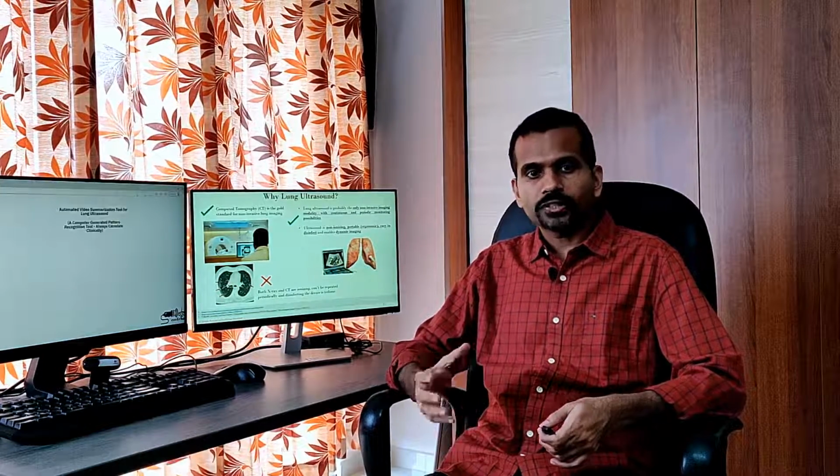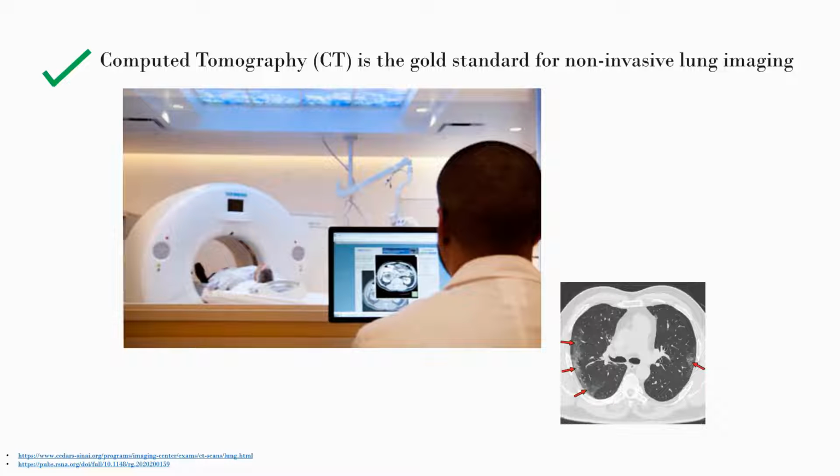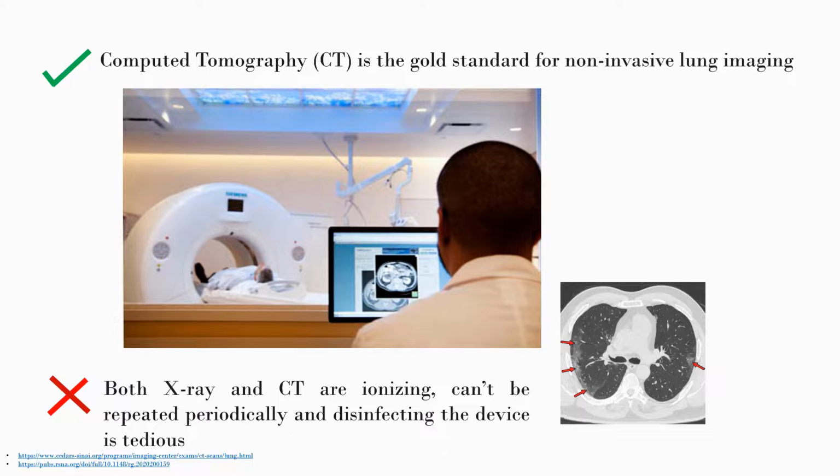With COVID-19 in the recent past, emphasis on non-invasive imaging of the lung has been gaining a lot of importance. And the gold standard for non-invasive imaging of the lung is computed tomography, or CT. However, the issue with CT is that it is based on ionizing radiation, hence it's not very useful for periodic monitoring of the lung. Portability of a CT unit is limited, so bedside monitoring is really not practical. And the most important aspect is that disinfection is extremely tedious.